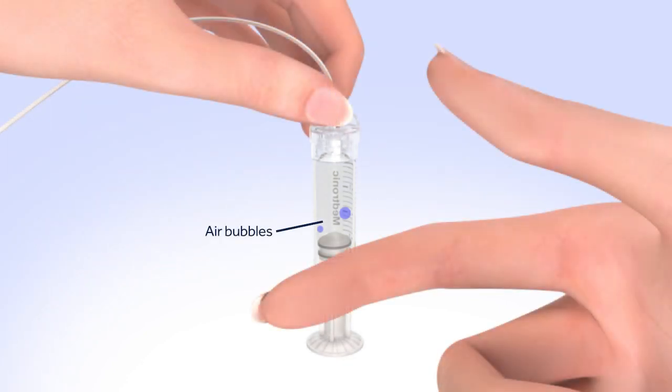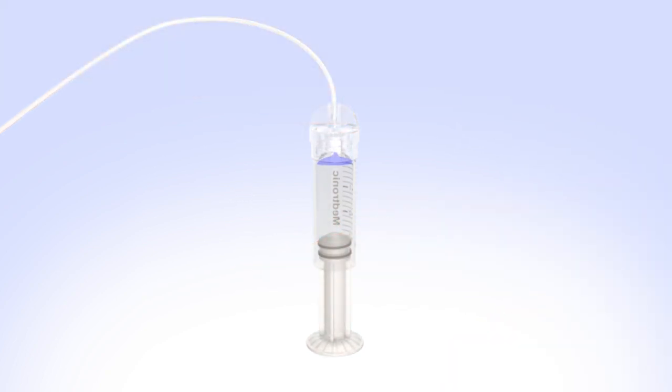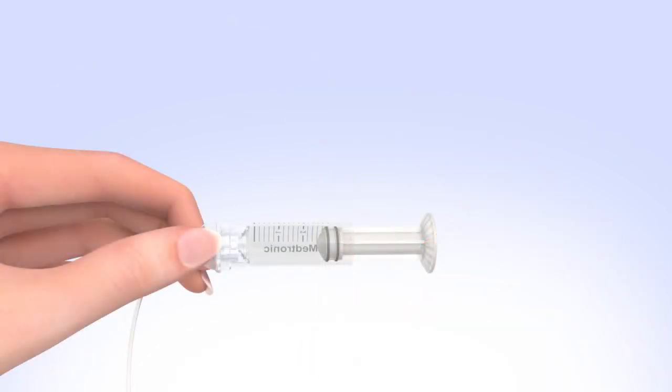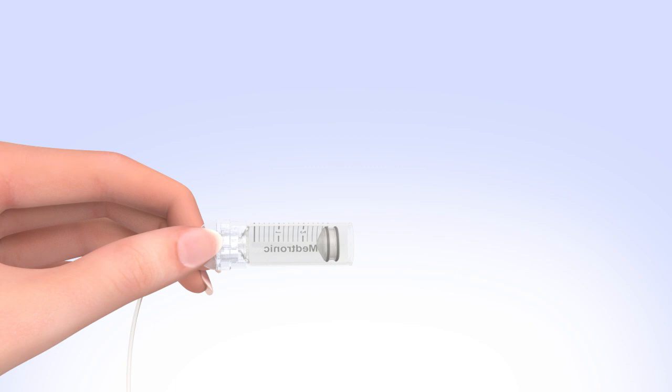Tap the reservoir to make any air bubbles rise to the top. Purge the air bubbles by slowly pushing up on the plunger until all air bubbles have been pushed out of the reservoir and you see a small amount of insulin in the tubing. If you're not able to push insulin into the tubing, disconnect the tubing connector and then reconnect it. Unscrew the plunger rod counterclockwise until it completely separates from the reservoir. Be careful not to pull down on the plunger as you unscrew it, and avoid squeezing the o-rings. The reservoir is now filled and connected to the tubing.